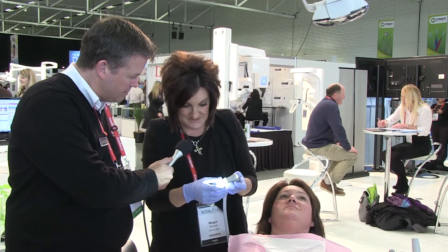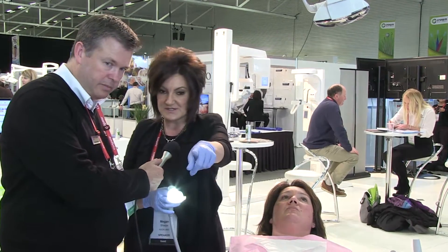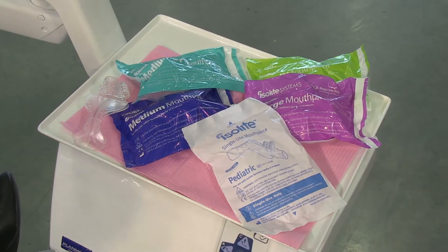The mouthpiece is attached to the base. These are single use, so they're disposable. There are a variety of mouthpieces — five in total — and they're designed to meet the anatomy and morphology of all mouths.